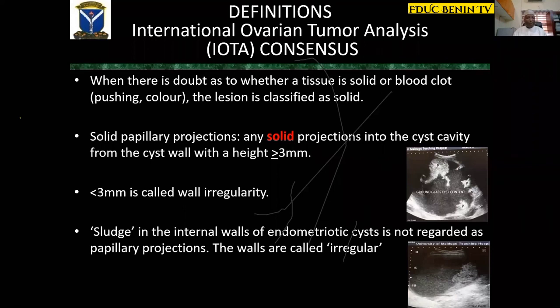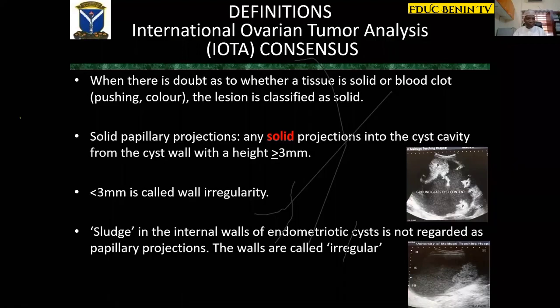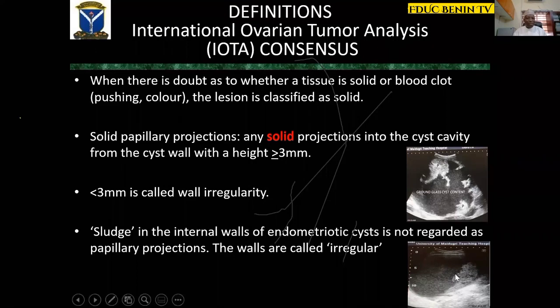A solid papillary projection is any solid projection into a cyst cavity from the cyst wall that measures greater than 3 millimeters, as seen in this case of advanced ovarian cancer in a 25-year-old. When it measures less than 3 millimeters, it is called wall irregularity, not papillary projection. In about 4 to 20% of cases of endometrioma, you will find endometriotic sludge. This should not be confused for solid tissue — it should be termed wall irregularity, not papillary projection. This should be considered wall irregularity.